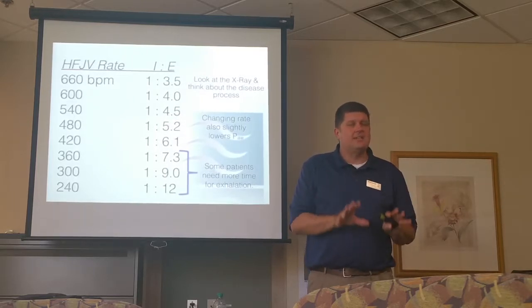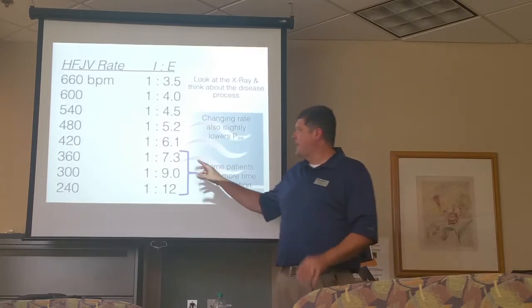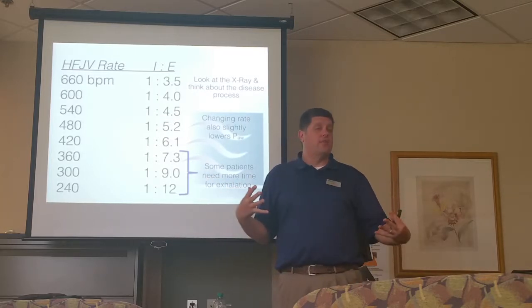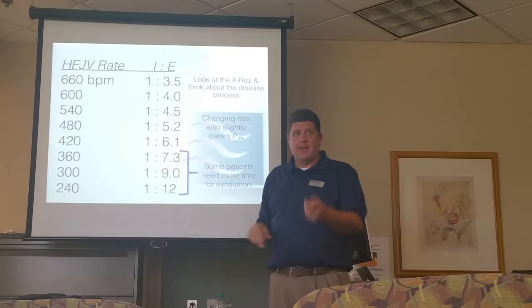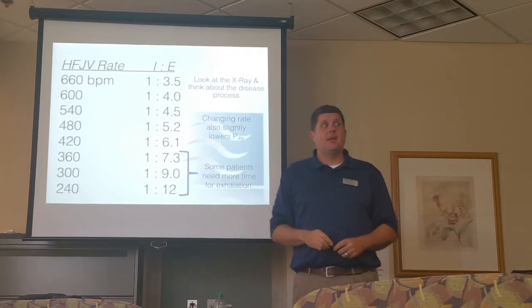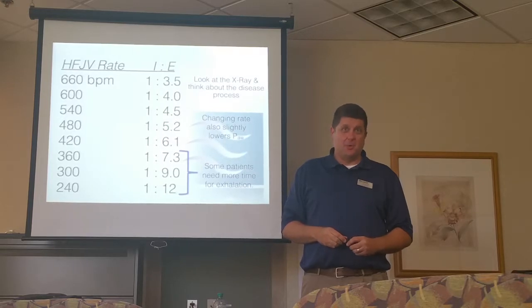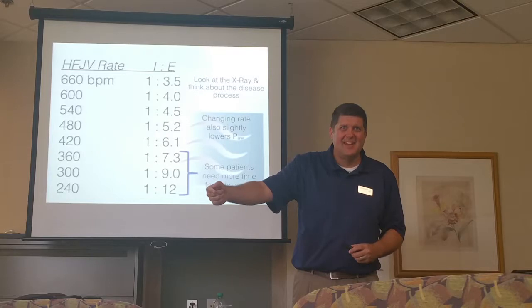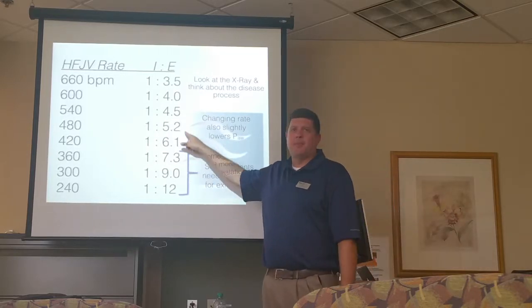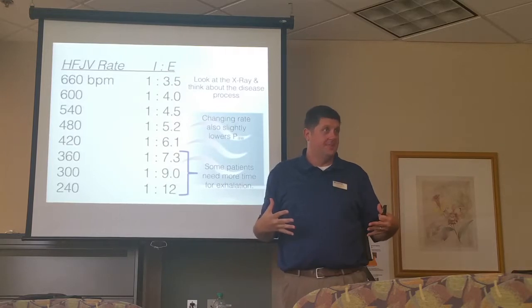Don't chase the CO2 with the rate, because that's where people get trapped. They have a high CO2, they're grossly overinflated, but they have a high CO2. They'll go up on the rate and get a blood gas in 20 minutes. And will that blood gas be good? Yes, it will. I'm not worried about the blood gas in 20 minutes. I'm worried about the blood gas 6 hours from now, okay?